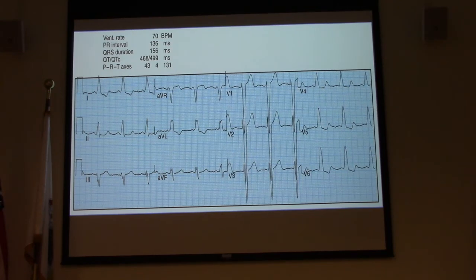So take a look here. We have a ventricular rate of 70. PR interval 136 milliseconds. So we've got a normal sinus rhythm. QRS duration is 156. So I take a look at V1, I have a negative deflection. This is a left bundle branch block.